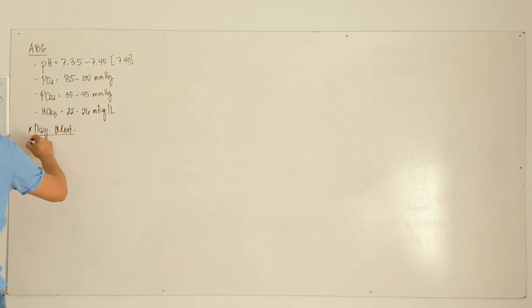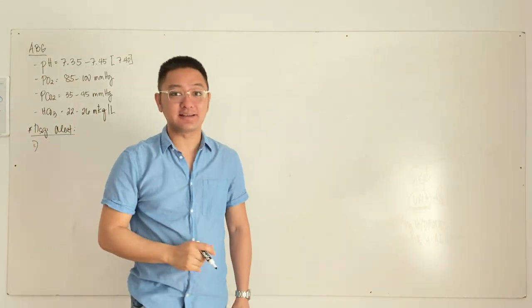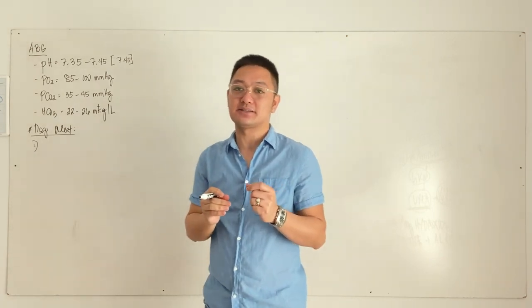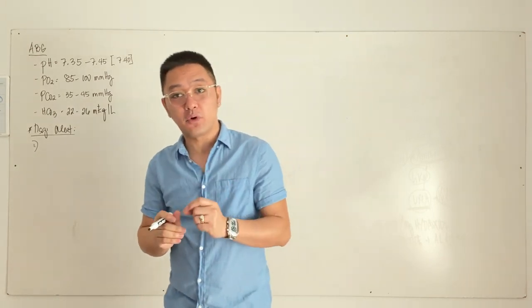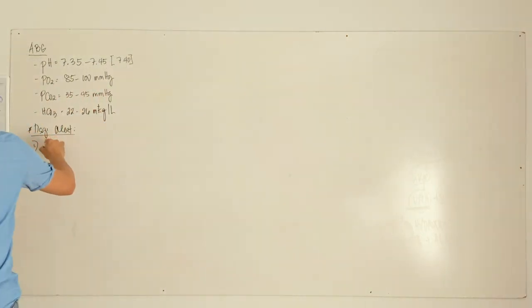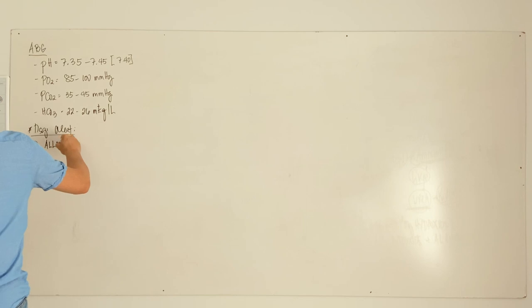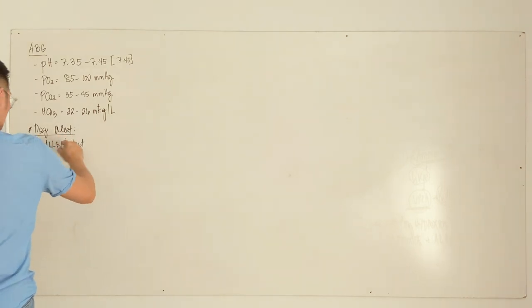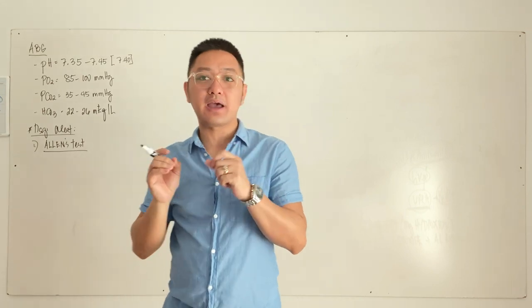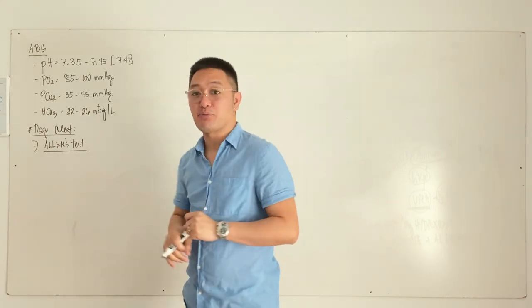What are the things you need to remember when you talk about ABG analysis? Before you extract blood from your patient for ABG analysis, there is a specific test you need to perform, and that is what we call your Allen's test. Don't worry, I will show a video file later on how Allen's test is being performed.